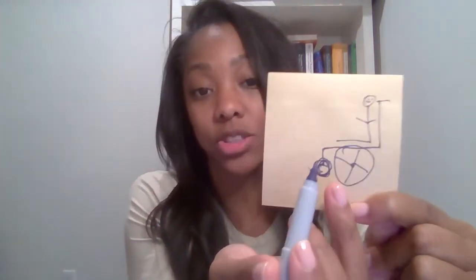What happens when we do this? So now that all of the weight is closer to the back of the chair, it is going to be more maneuverable because it is tippier. So the weight is not on the little casters up here, because the casters determine how you swivel in your wheelchair, right? When you zip around in a wheelchair, the casters help with that.